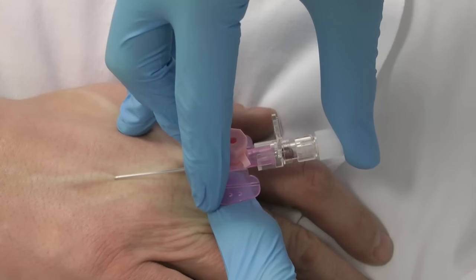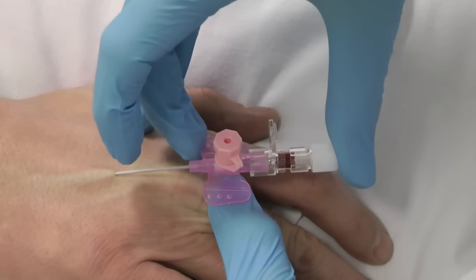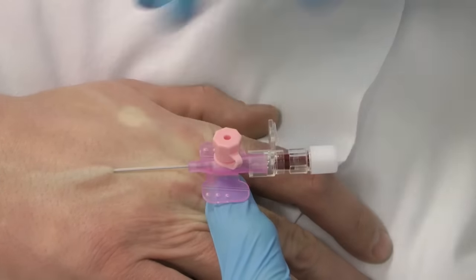Anchor the skin. Insert the needle. Level off. Note the first flashback.